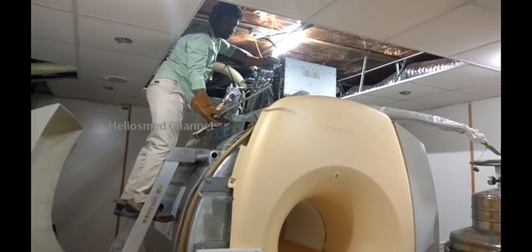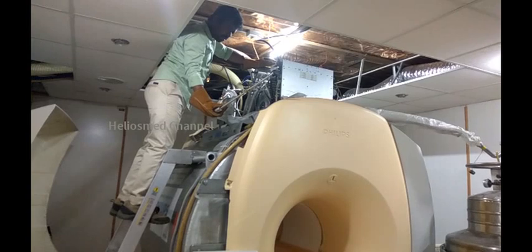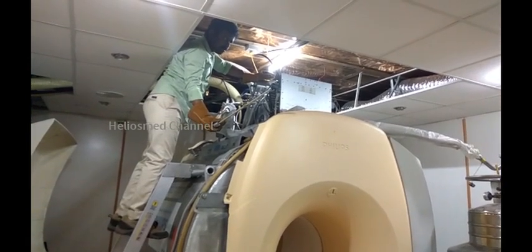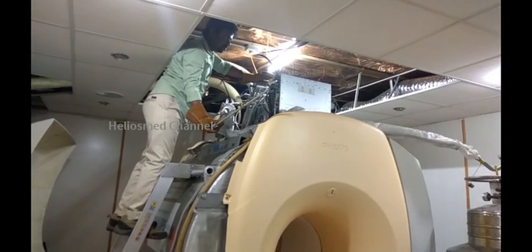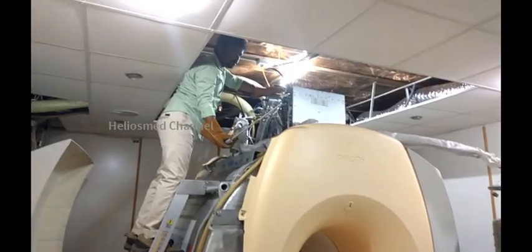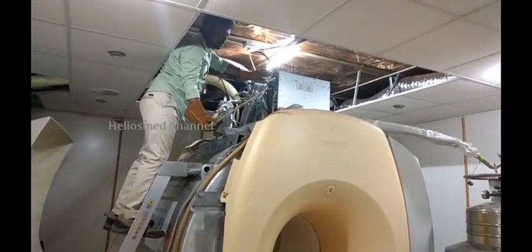This liquid helium cools down the coil to minus 269 degrees Celsius to keep the coil in a superconductivity state. Once the superconductivity state is maintained, you won't see any issue. Otherwise, the magnetic field will disappear — what is known as a quench.